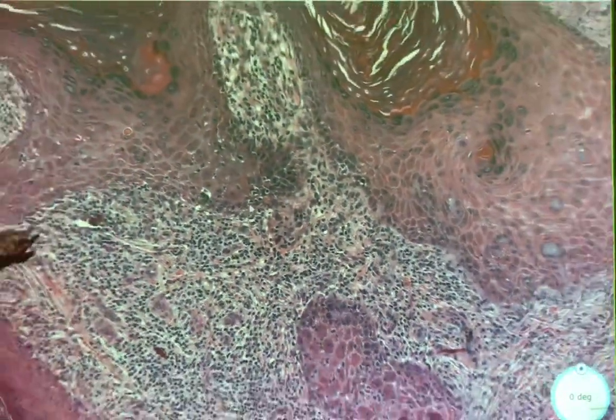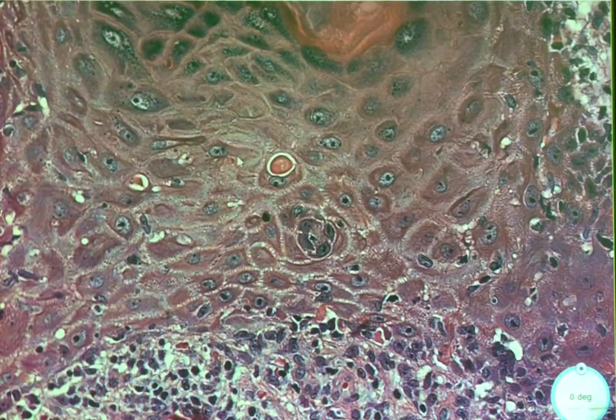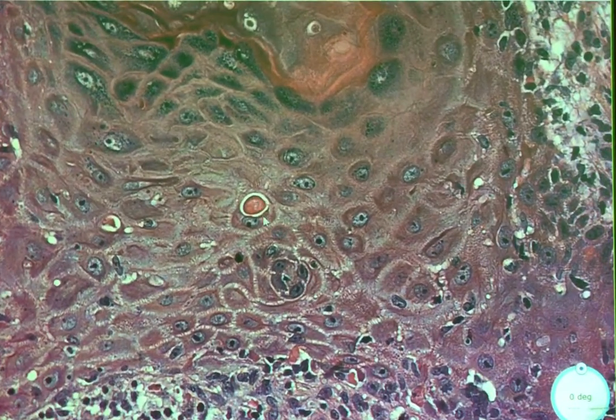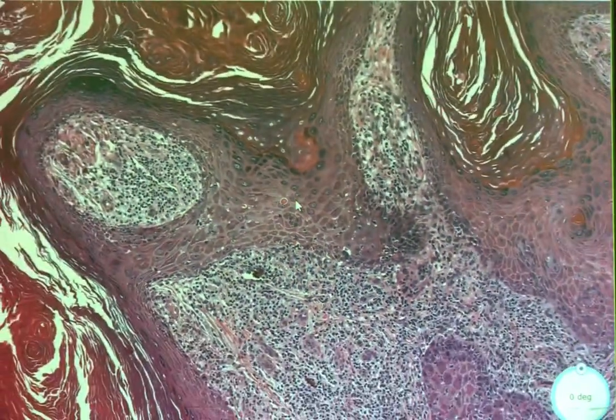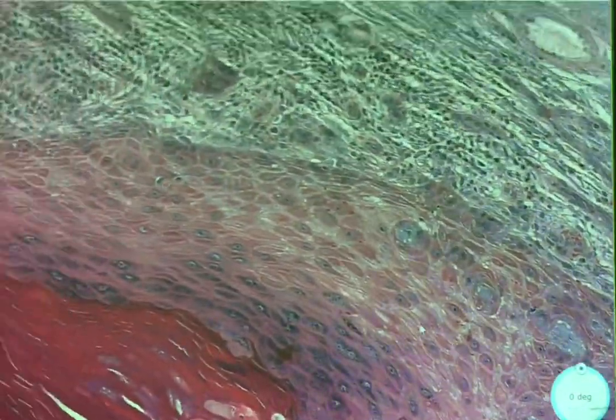Ooh, wait. What's that? What's that thing called again? I can't remember what that thing was. That is a dyskeratotic cell. It's just one cell? Mm-hmm. That is a sign of unhappy epidermis. I just wanted to point it out because that is beautiful. That is picture perfect. And also something you see in this lesion, not uncommon. So we established this is dyskeratotic.